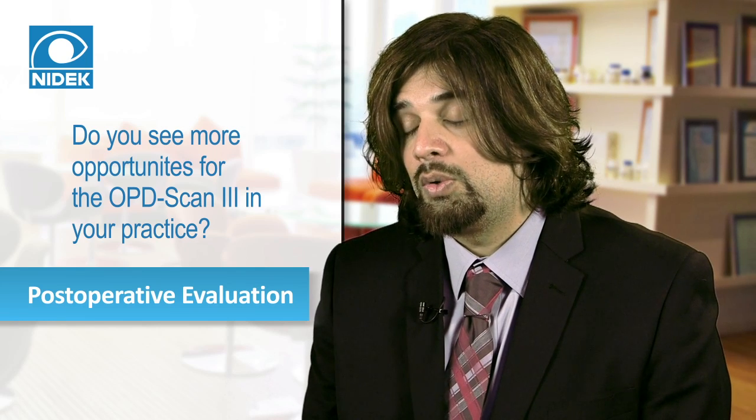Where we really have had further interest with the OPD-3 has been also postoperative evaluation. Sometimes we have patients where we're uncertain as far as what maybe the visual complaints are, what the issues are, and being able to get the entire wavefront, looking at the cornea as well as looking at the internal optics, is very handy. So for example, we can assess the toric IOL position and toric IOL power in relationship to the corneal power. This is helpful in terms of evaluating any residual cylinder.